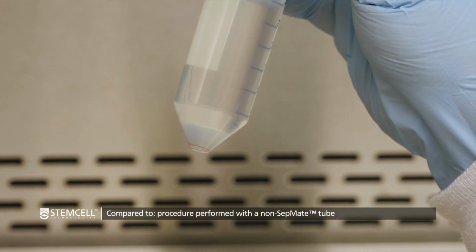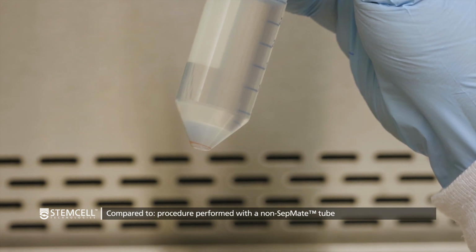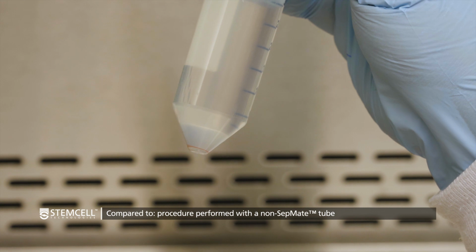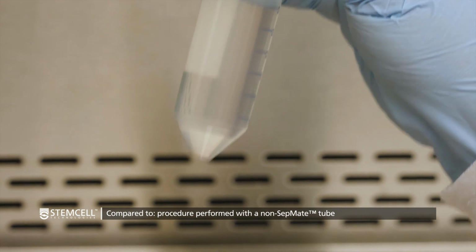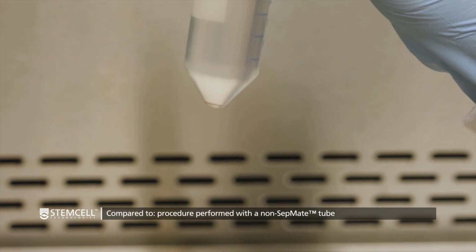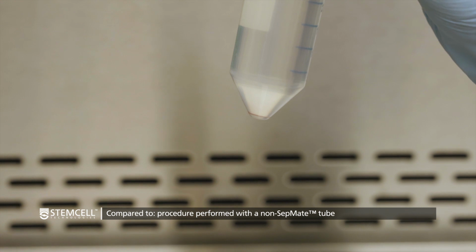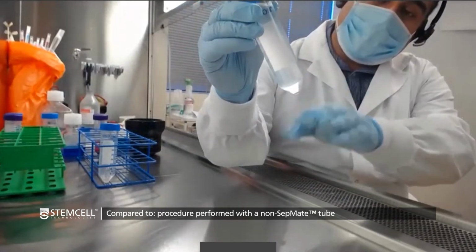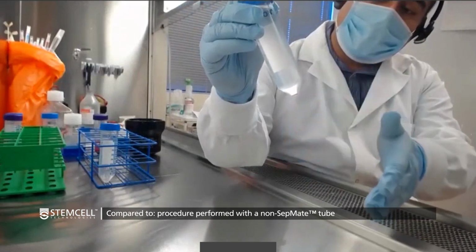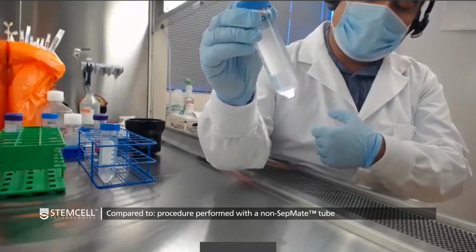Okay, so it really talks to how SepMate just makes your density spinning faster and easier, but it's not supposed to enhance the removal of red blood cells or granulocytes from the PBMC layer. That is more of a biological constraint and consideration that the extent of which will vary depending on the donor-to-donor variation. The extent of the amount of red blood cells will depend on the donor and also how much time has elapsed since the blood has been drawn from the donor.